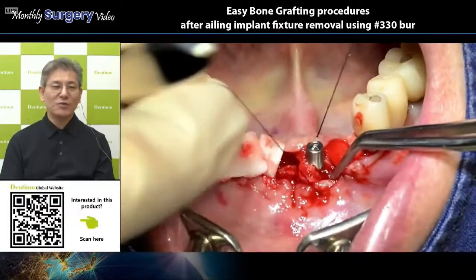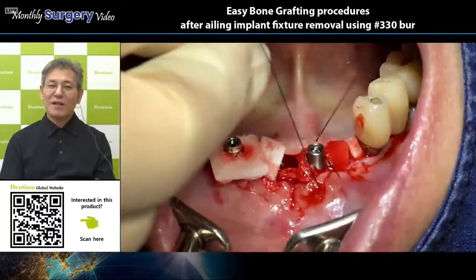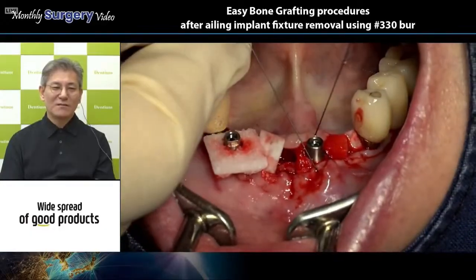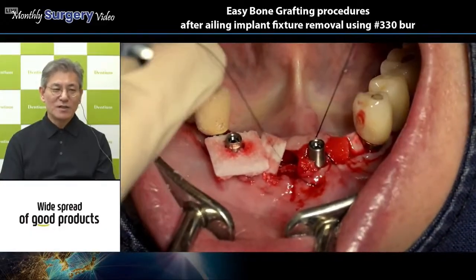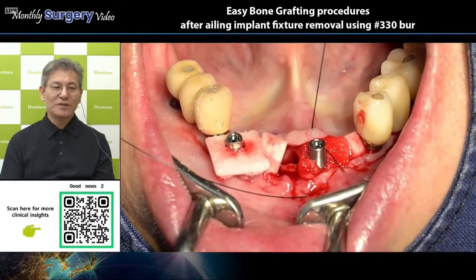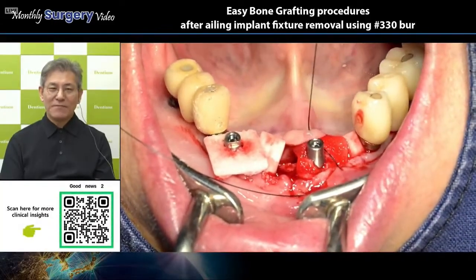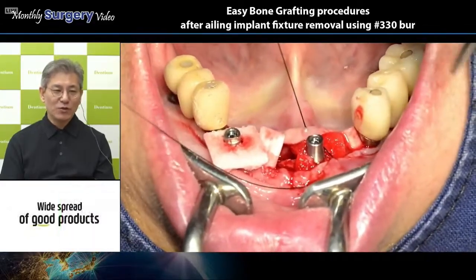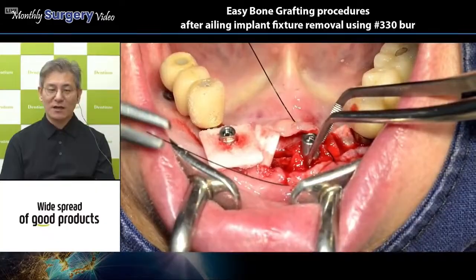Vascular driven epithelialization, that is the correct term for explaining using this collagen graft. The vascular driven epithelialization will be achieved when we use this collagen graft.